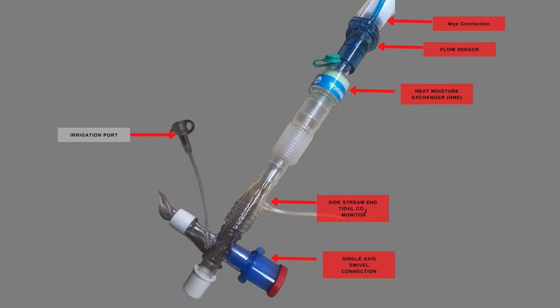So, the circuit setup is such that everything after the Y connection makes the circuit functional. So in this particular case of the ventilator, we have a flow sensor, we have an HME, which is a heat moisture exchanger, we have a side stream end-tidal CO2 monitor, as well as the inline suction, which a lot of people are used to seeing.